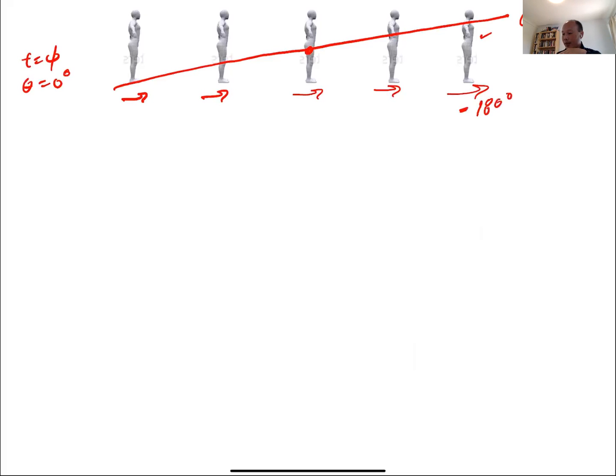This spin is going to go minus 90 degrees at every time step. This spin is going to go plus 90 degrees because it's lagging behind the spin at the isocenter. And this spin is going to go plus 180 degrees at every time step. Basically, the farther the spin is away from the isocenter, the more phase increment it's going to acquire for every time step.